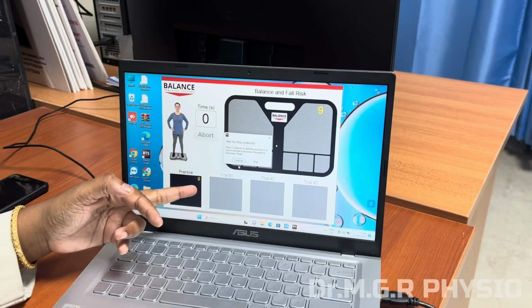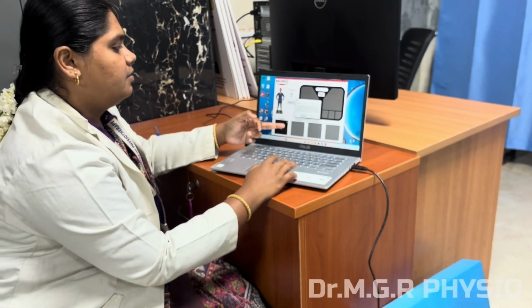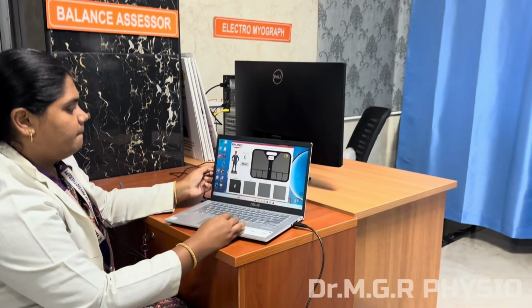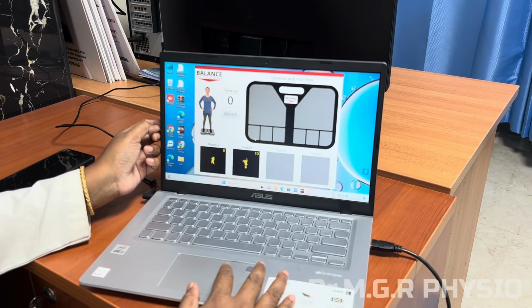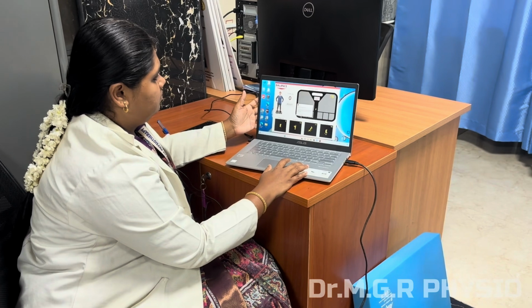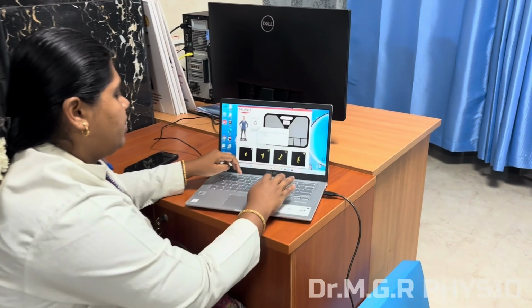So this is a practice. Next we will continue with trial 1. Now I'll go with trial 2. So all the trials are over. I'll save it.